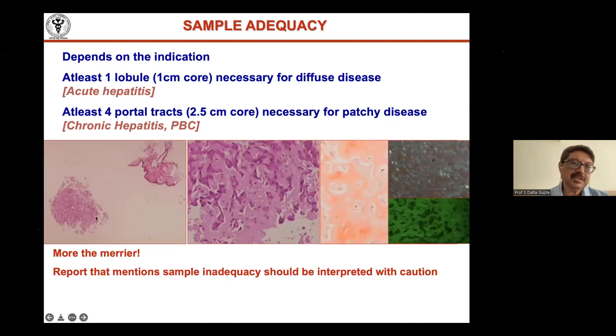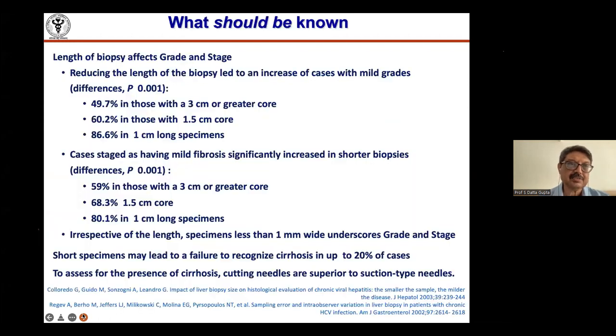So in fact, it was 2 or 3 millimeters in size. This was more than enough to make a diagnosis. But generally, for most indications, you require a good core, or at least 4 to 5 portal tracts. Now, the length of biopsy matters, especially when you're doing grading and staging, because viral hepatitis, chronic hepatitis is one of those diseases where you do liver biopsies. NASH is another. And of course, post-transplant acute rejection, you do a rejection activity index. So for all those, it's better to have a fairly adequate length of biopsy.